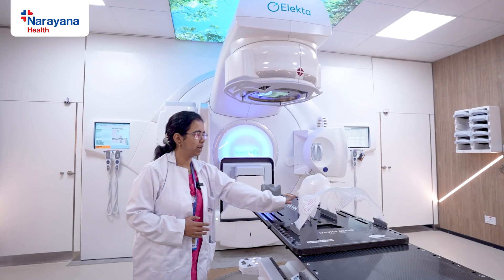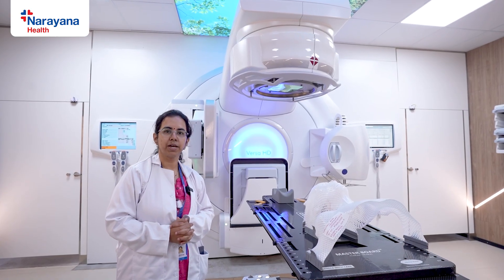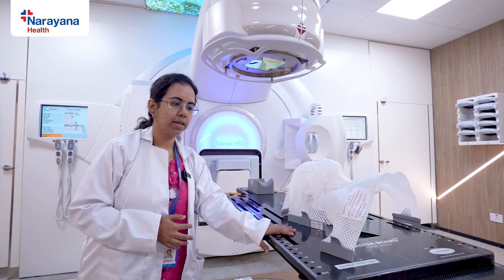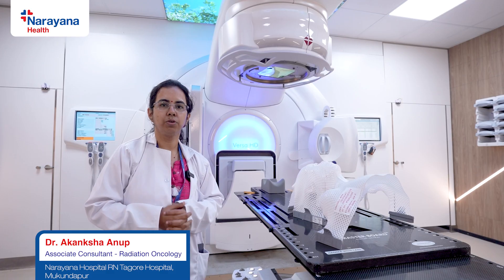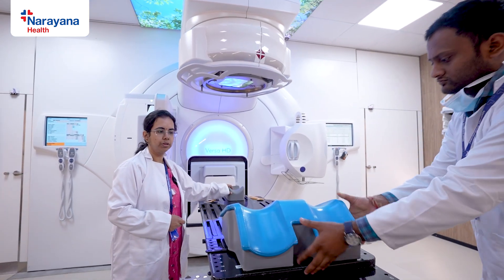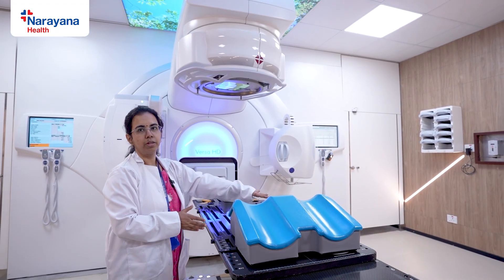For neuro and head and neck patients we use these plastic masks. For other cancer sites such as gynaecological or prostate, immobilization devices are less specific. Some may prefer using a vacuum bag or a plastic mold in the pelvic region, while others prefer just using a headrest and a kneerest. We also give a bladder protocol to all patients being treated in the pelvic region to help prevent bowel toxicity. The patient lies down with the knee joint placed on the kneerest. We maintain the curvature of the spine, and this is how all pelvic patients get treated.